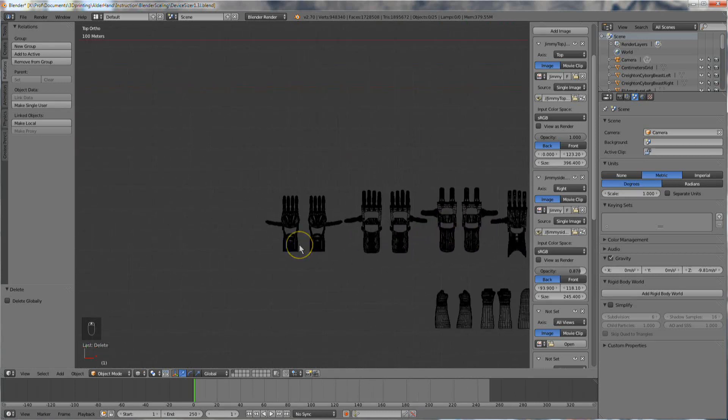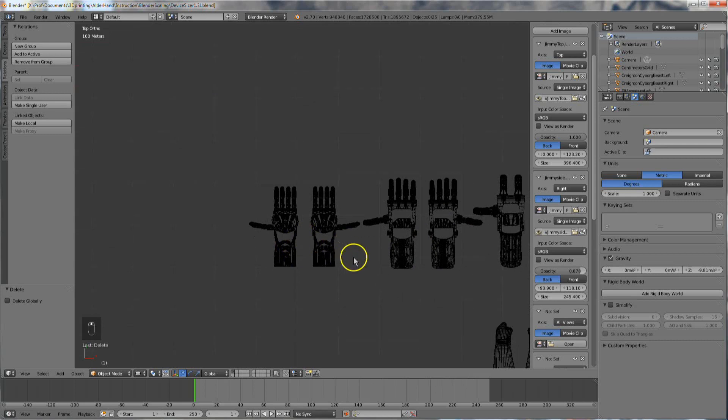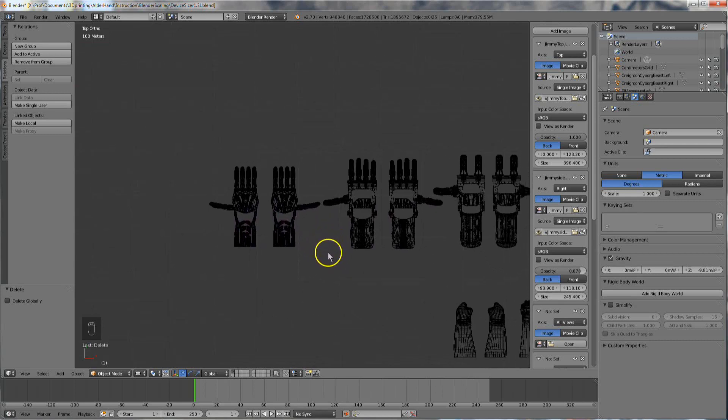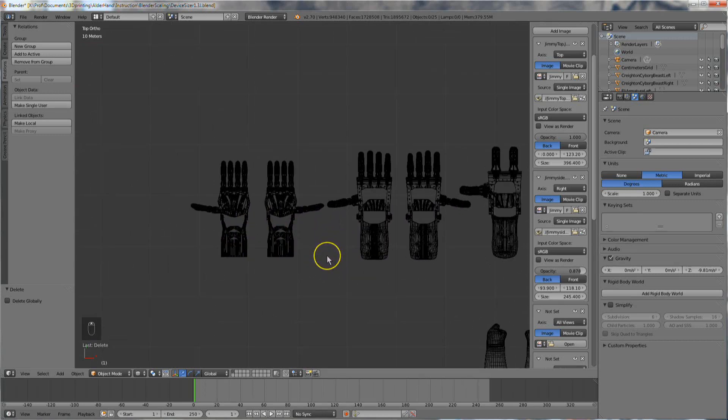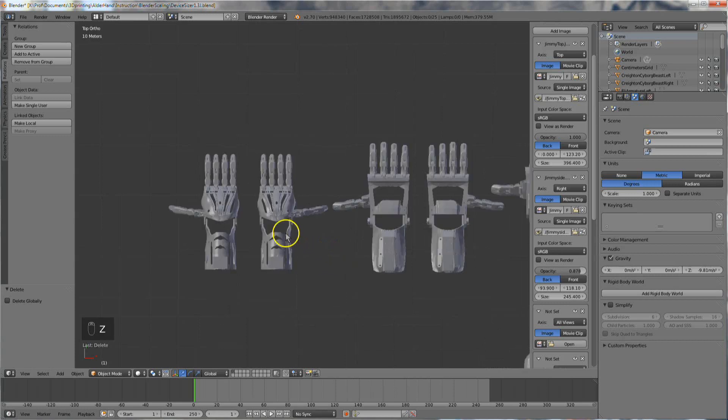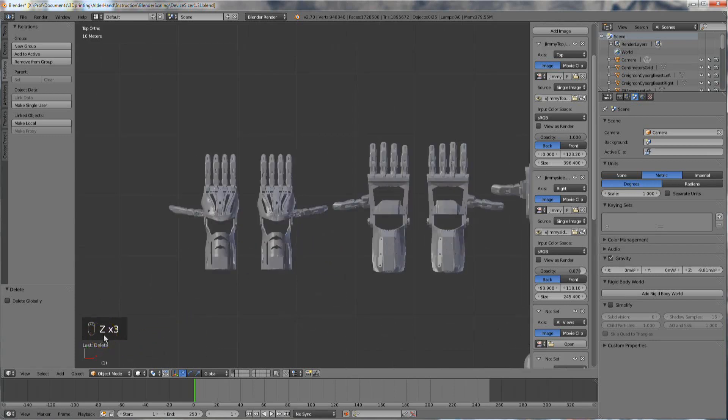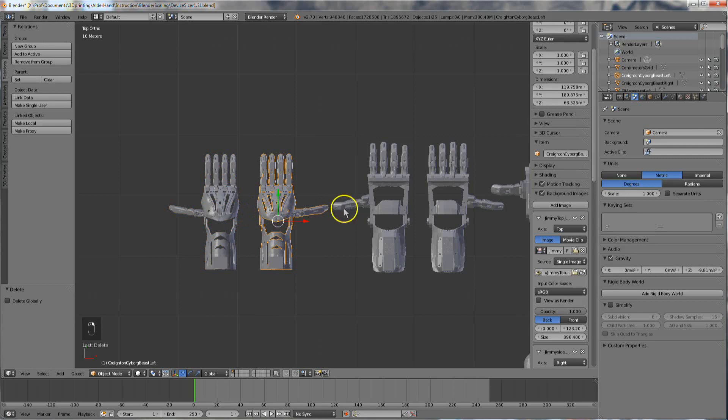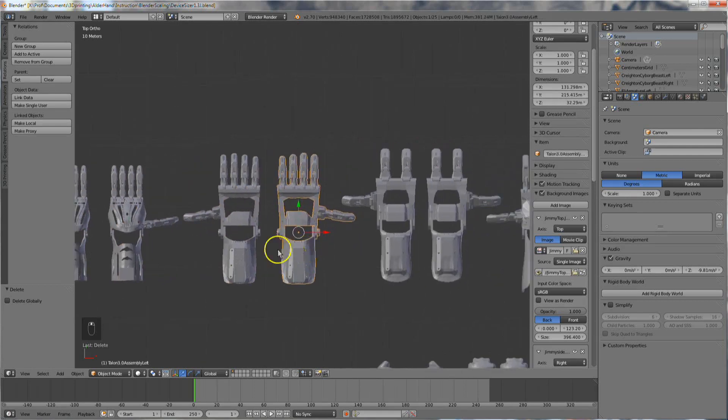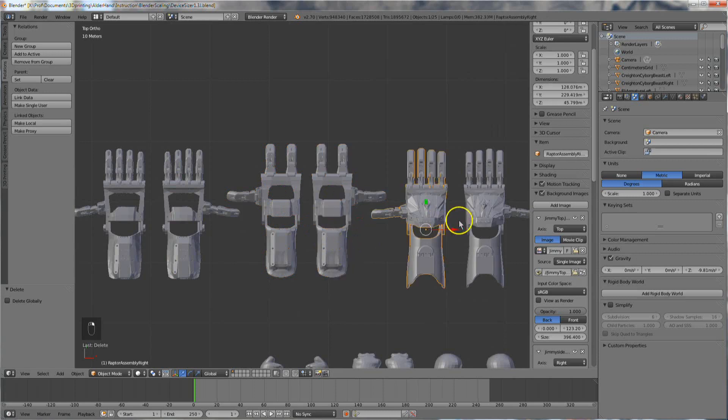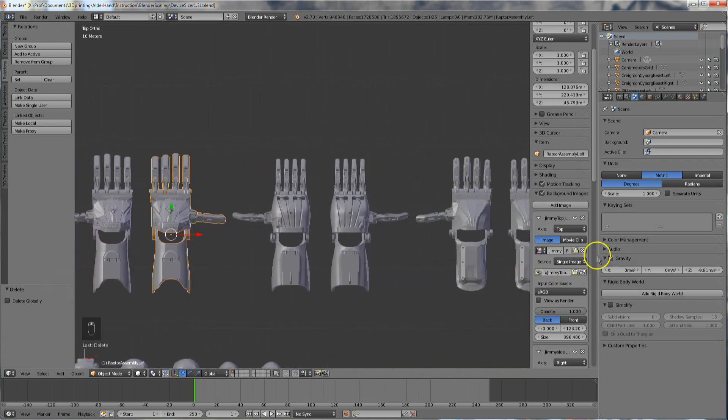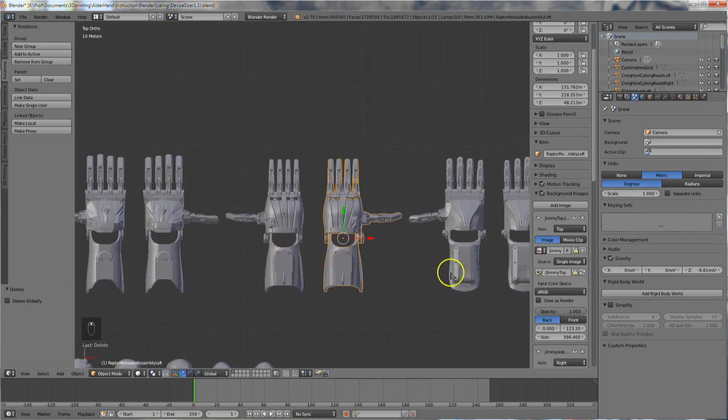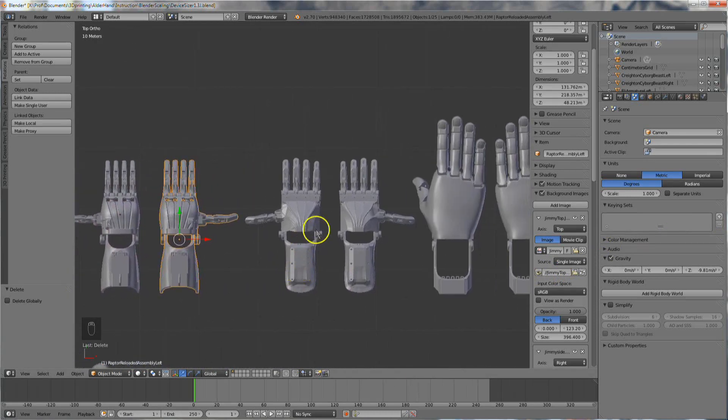Here is a row of wrist-powered devices for both the left and right hand. The Z key toggles wireframe view. Right-click selects a device. Here we have the Cyborg Beast, the Talon Hand, the Odie Hand, the Raptor Original, the Raptor Reloaded, the Osprey Hand, and the Flexi Hand 2.